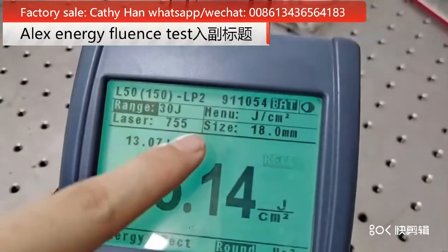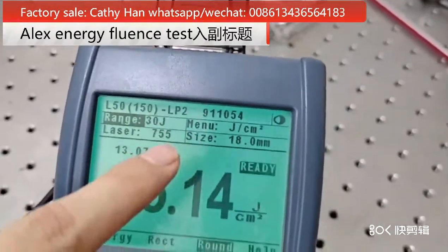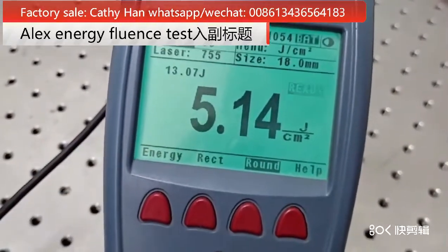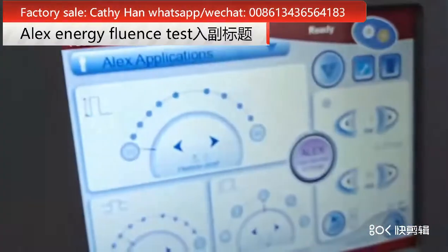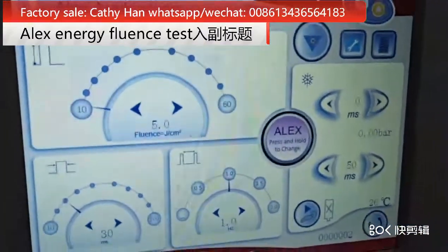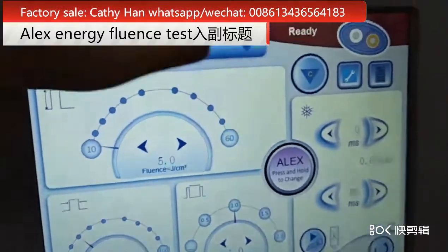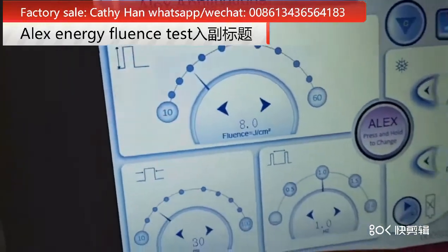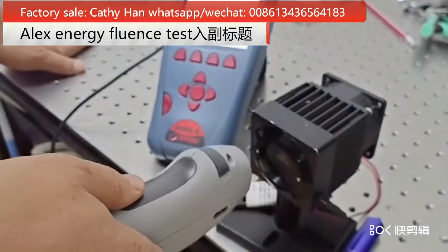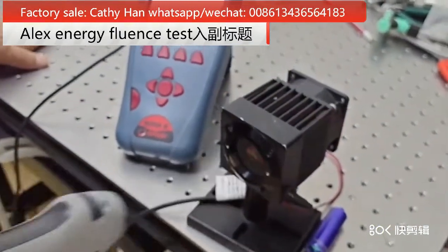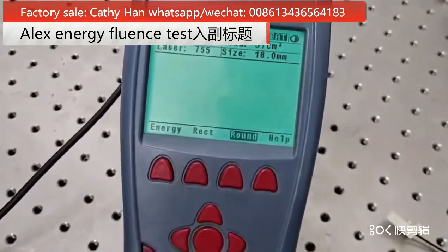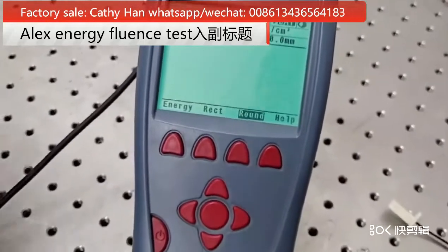We can see here the unit is Joule per square centimeter. The result is 5.14, and we can see on this screen also 5. The difference is not too big. We can try another one, for example 8 — we can see here is also 8, around 8.14.